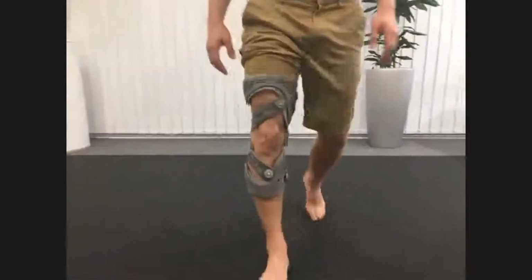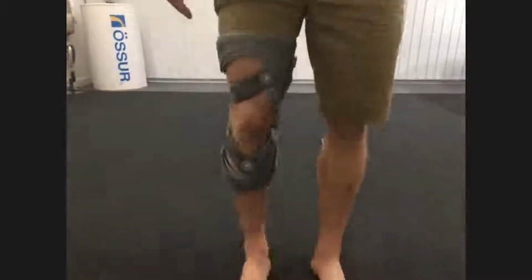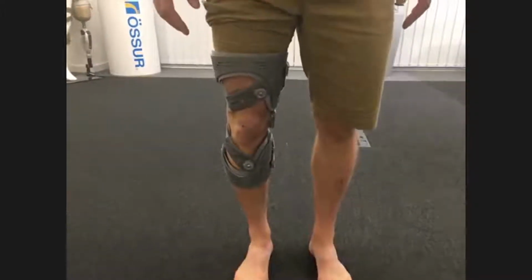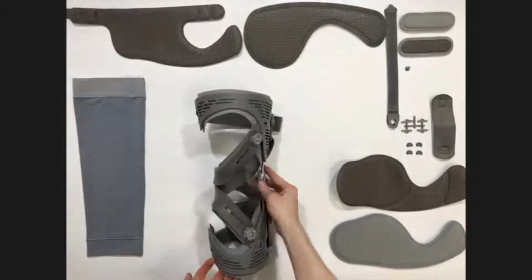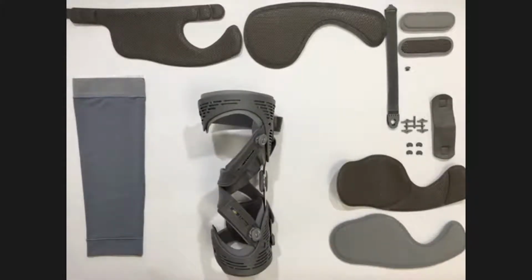Okay, so we've got a good normal fit of the brace there, and we can then go on to talk about when and how you'd use some of the accessories that we have for the unloader. So these accessories allow you to accommodate and suit the brace to different patient groups. So we've got solutions for patients that have got sensitive skin. We've equally got solutions for patients that need improved suspension if they're highly active, or for example, they're getting any slippage. So we have our brace here exactly as was fitted to Pete.